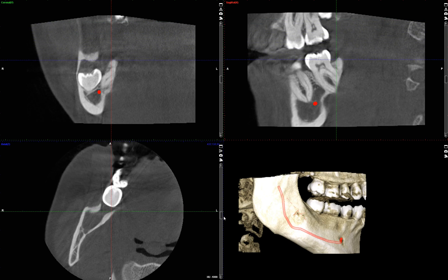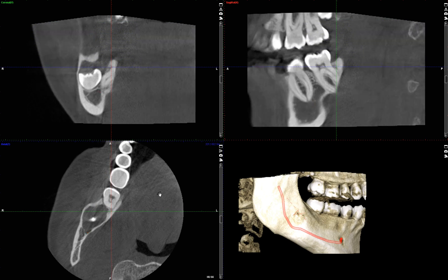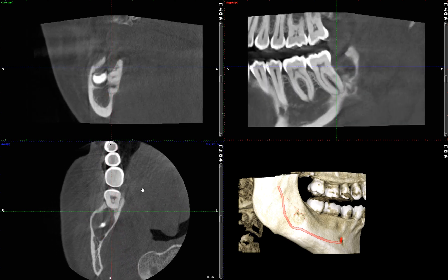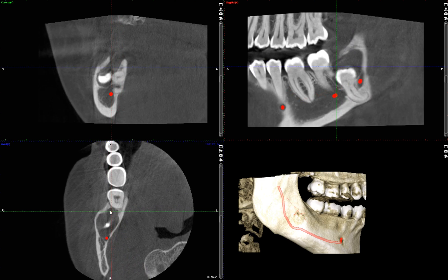Now we're getting into the area of the mandibular arch. Do you guys see there's a large radiolucency? To help you visualize this area better, I'm going to rotate this volume and bring it over so I can put my red line across the arch, giving you the sagittal view, which you're a lot more accustomed to seeing — it's much easier to visualize this way.